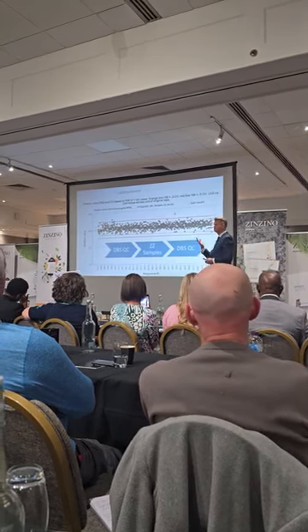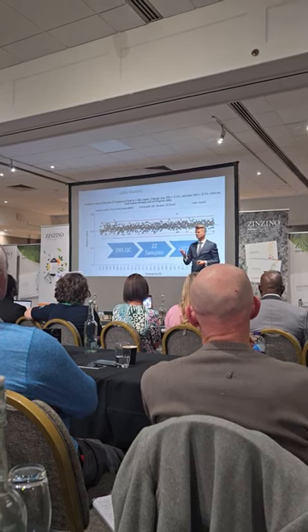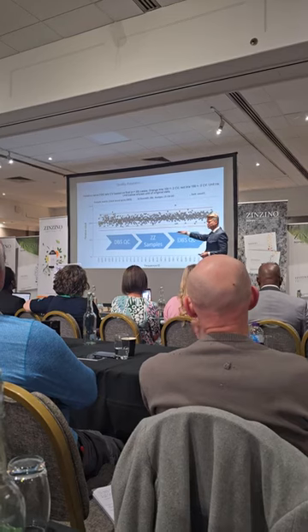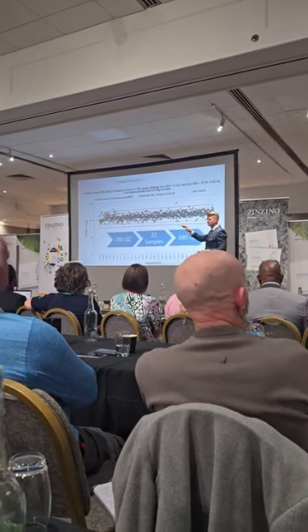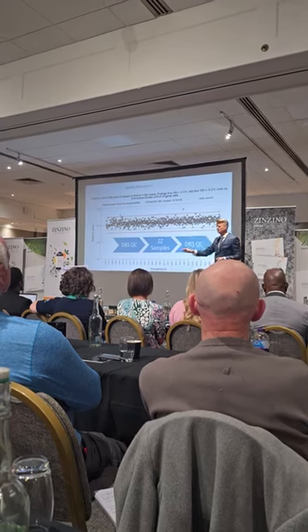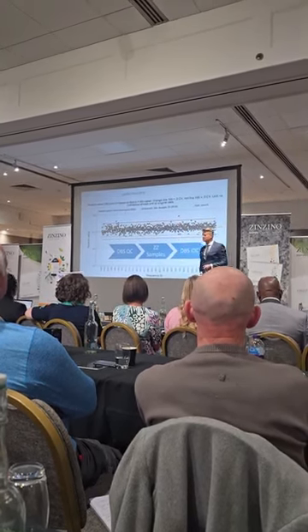Yeah? So we can use this as a tool, and you can see each of these dots here, they are one measurement, one sample. They are not identical, but they are very similar. But most importantly, we don't see any trends going up, trends going down. Or we're also looking for extremes like this one here. See that?